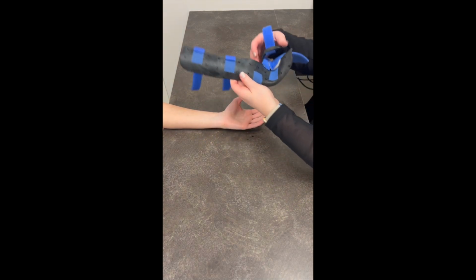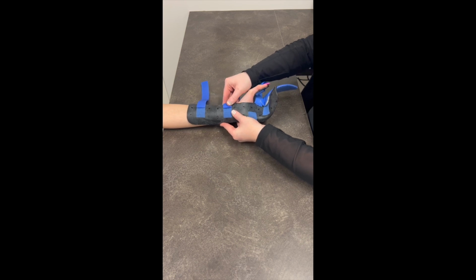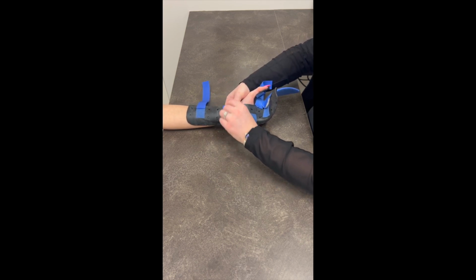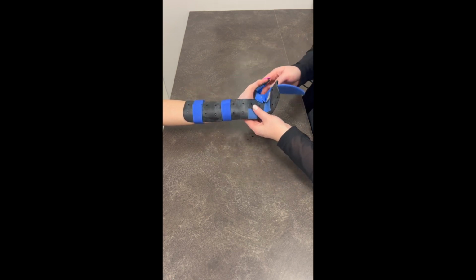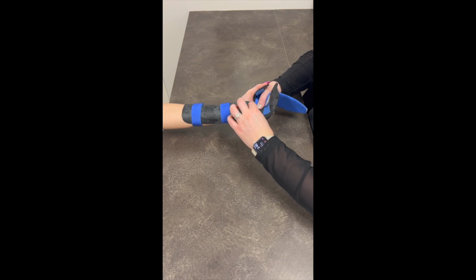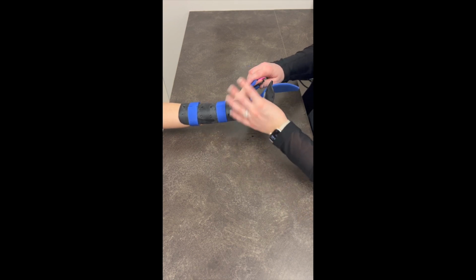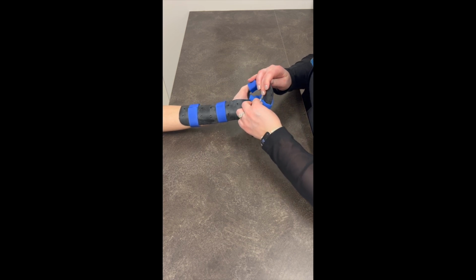Here's the final product. So we'll don it on the patient, and then we'll have one strap around the wrist, one around the forearm, one on the dorsum of the hand, one around the thumb, and then one around the fingers.